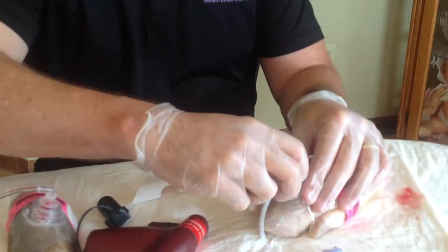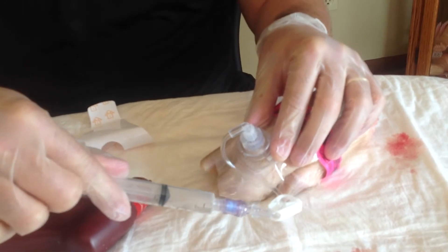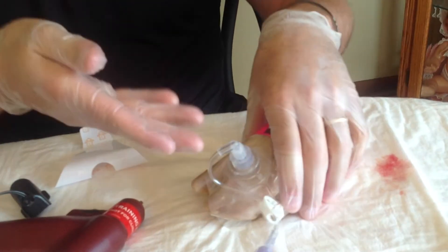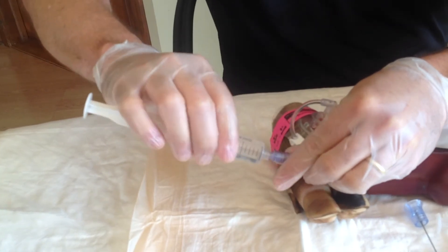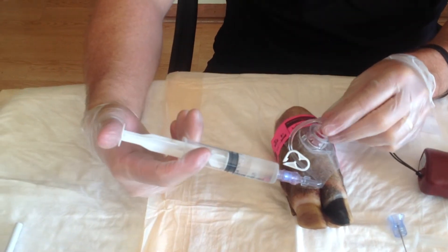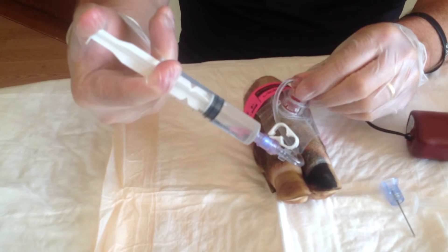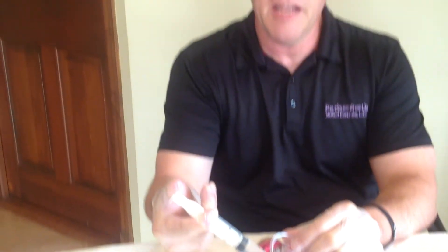Once it's in place, we simply screw on our extension tube. As they teach in the books, you can hook your syringe up and try to aspirate bone marrow back. Sometimes you get bone marrow and sometimes you don't, but you can still be in the right spot even if you don't get bone marrow back. Once it's in place, we go ahead and give our saline flush — that way we can clear the stuff out of the way before we give our medications. When it comes to the push, it's best described as pushing an amp of D50 through a 24-gauge IV. If you've ever tried to do that, you know the amount of resistance you're going to get. Many people the first time find that it's not nearly as easy as the book would make it sound to push fluids into the space.